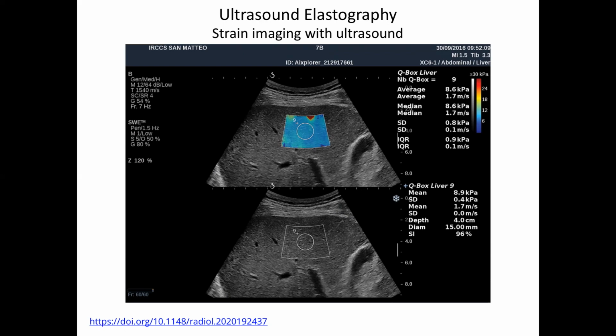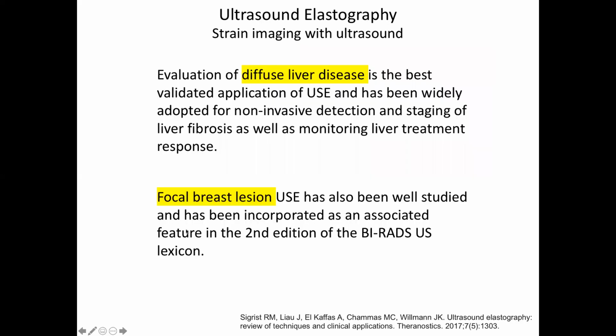It's an interesting look at a technology at this phase where they're trying to establish it. We've got all of these commercial scanners now that are producing different numbers. Who should you believe, kind of thing?